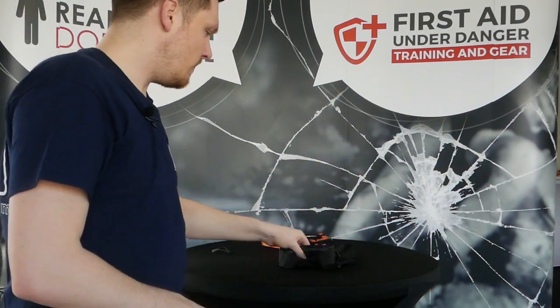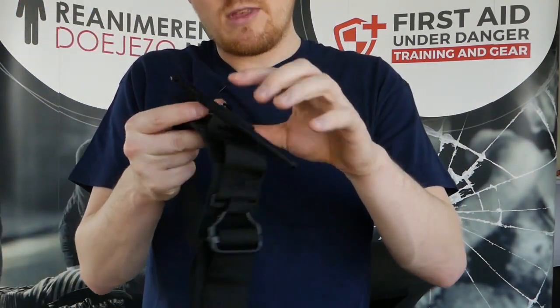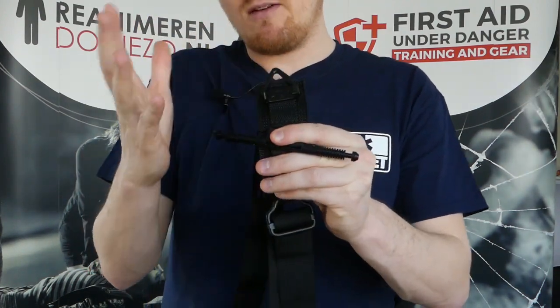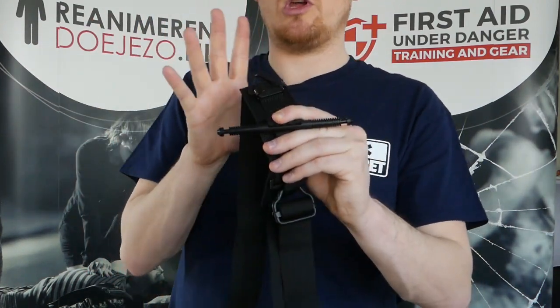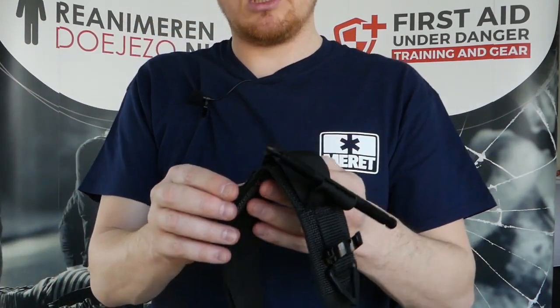So they were speaking to resolve that by placing the open C buckle in there, but it never really happened until now on a Generation 4. But does it make it any simpler to use?